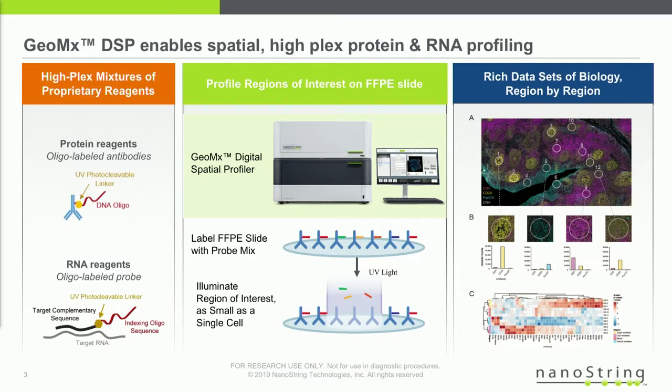What that allows you to do is saturate a single FFPE slide in one single step with as many independent antibodies or FISH probes as you wish. All those probes are invisible, so you don't see anything in the microscope. So we take those thousands of probes onto the tissue slice, and we dope in, say, 4 fluorescent colors that allow you to see the overall tissue geometry, like you can see on the right side of this slide.